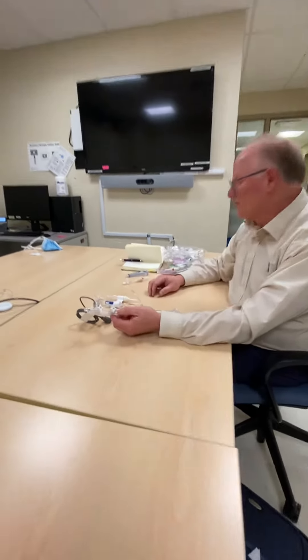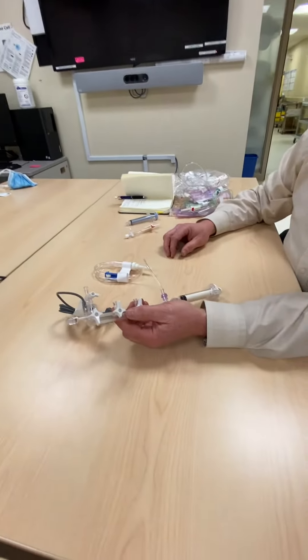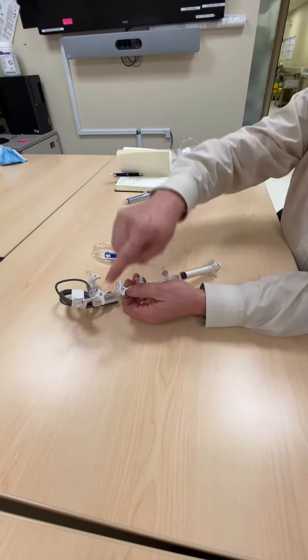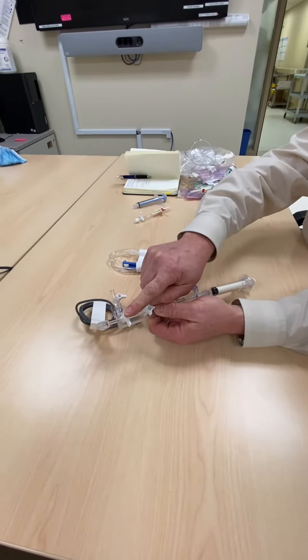Okay, so this is essentially your 360i, and what's different about this is that this is a four-way stopcock instead of a three-way.